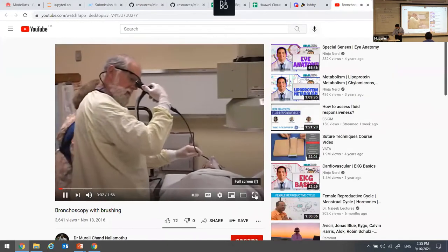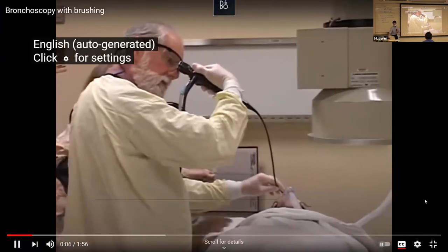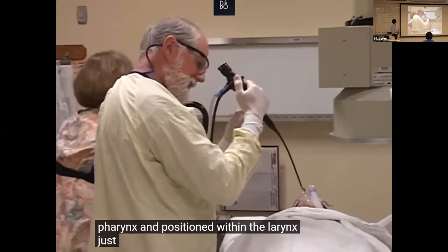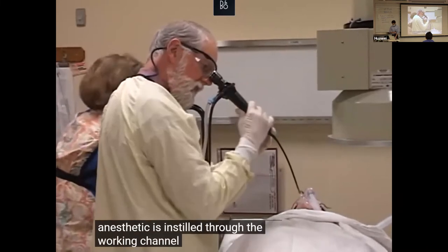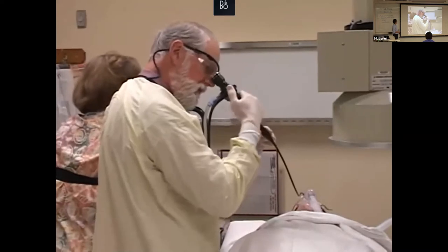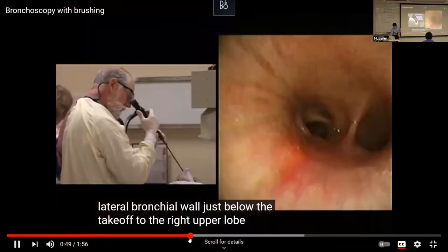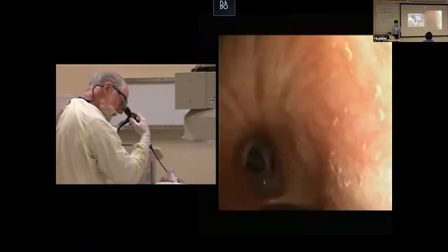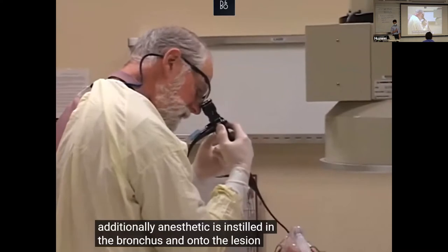After preparation with a topical anesthetic, the flexible bronchoscope is inserted through the right nares. The scope is advanced through the nasopharynx and positioned within the larynx just above the vocal cords. Additional anesthetic is instilled through the working channel of the bronchoscope onto the vocal cords. For lobe. So it's deep inside. Additional anesthetic is instilled in the bronchus and onto the lesion.